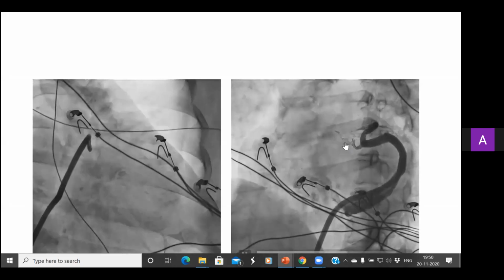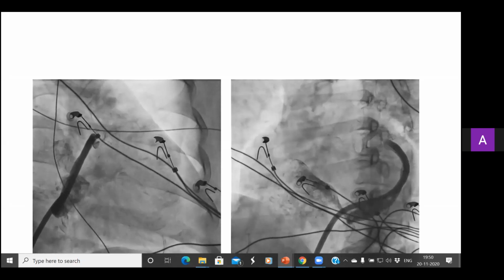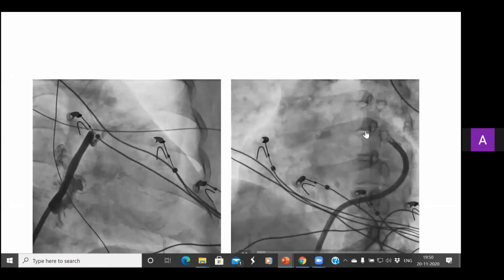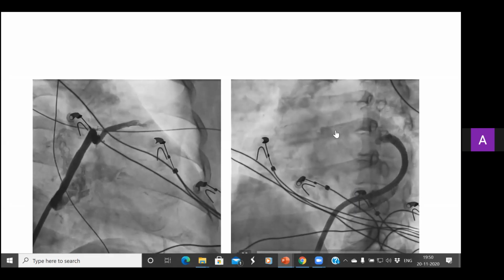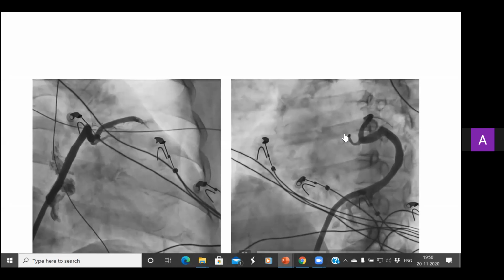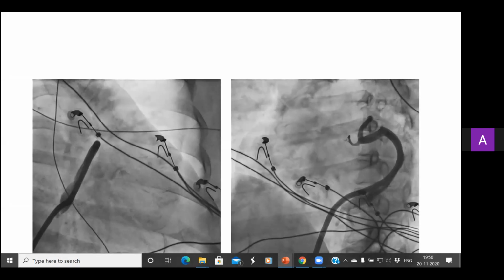So in one of our patients' venogram, we see the narrowing caliber towards the GCV-AIV confluence and a small communicating branch across the midline draining into the GCV. Roughly, this is the area corresponding to the more basal and inaccessible portion of the LV summit close to the proximal coronaries.